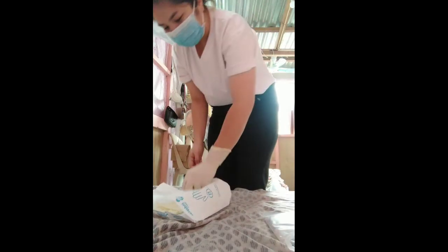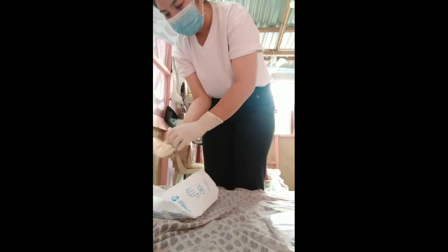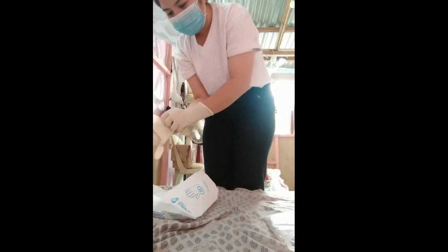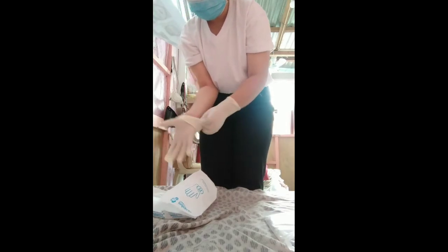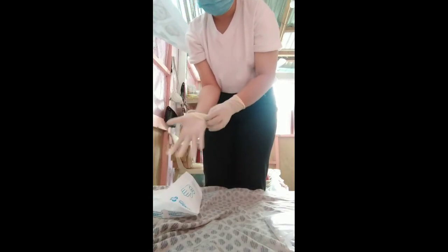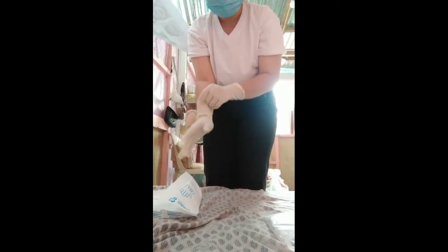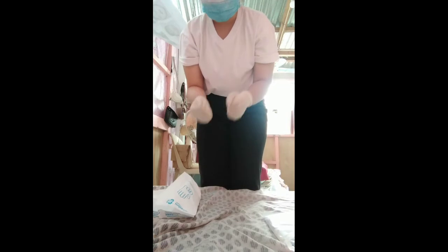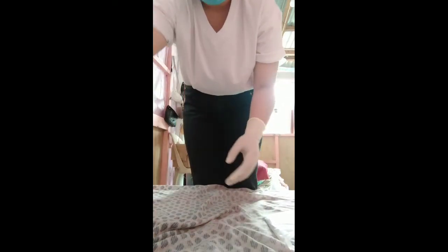So the next one. So here, perfect. Put away the plastics.